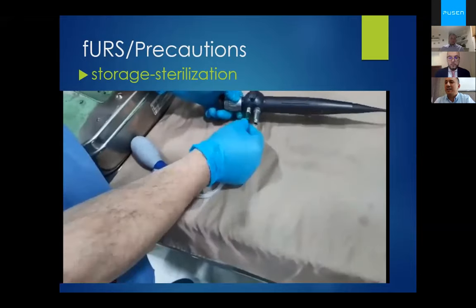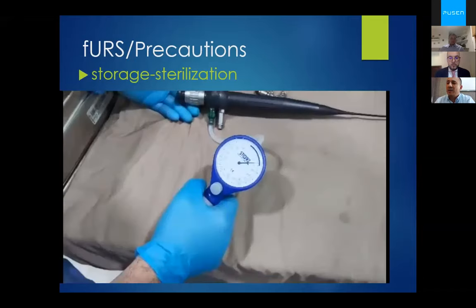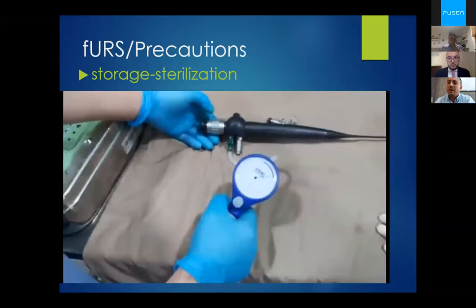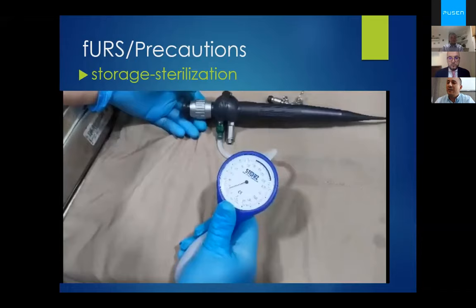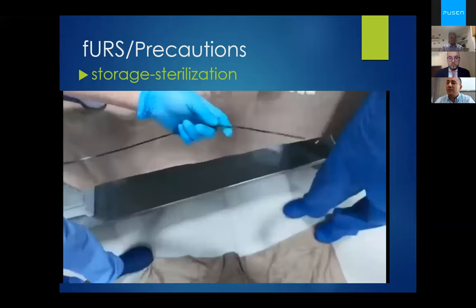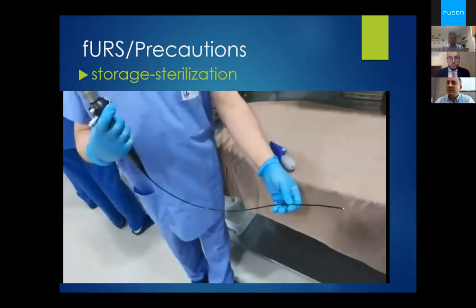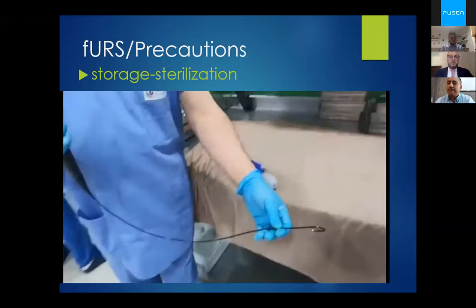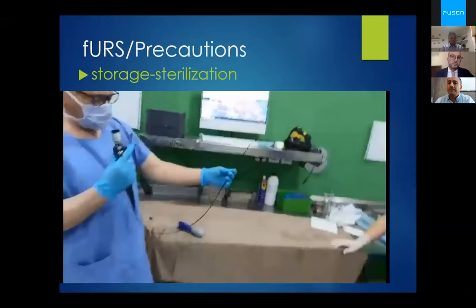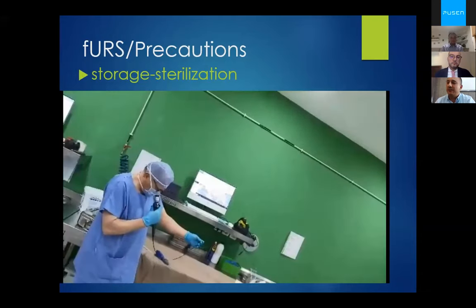We must always check tightness, flexibility, deflection, and visibility before and after any ureteroscopy procedure. We must be delicate in moving the scope. Here in our unit, we have only one dedicated OR technician who does these precautions, Mr. Adel. He checks deflection, visibility, flexibility. Visibility, okay. In the beginning and at the end of every procedure, I advise this.